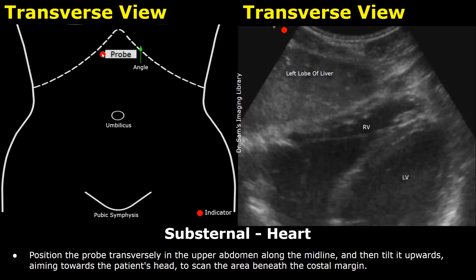The FAST scan starts by placing the probe in the midline transversely in the upper abdomen, just below the sternum. It is then tilted or angled towards the patient's head, and the area beneath the costal margins is scanned. Placing the probe in this manner will produce this type of image.